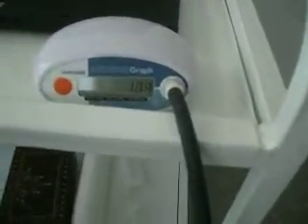In the first phase, a simple blood pressure measurement will be performed. And this is a very nice feature of the device, that you can see the registered oscillation online.